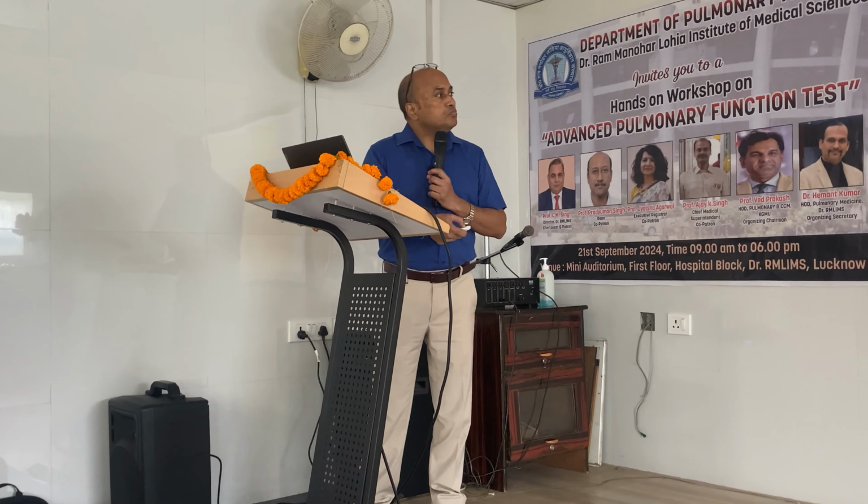These are gas dilution methods, and the principle for the gas dilution method in both cases is similar. But one limitation of the gas dilution method is that only the airway or alveoli that are connected with the airway get the gas and it undergoes dilution. Those not connected with the airway, there is no dilution. It means the part of the lung that is not connected to the airway, we don't measure. This is the limitation. And the trapped air, in fact, is not measured by the gas dilution method.